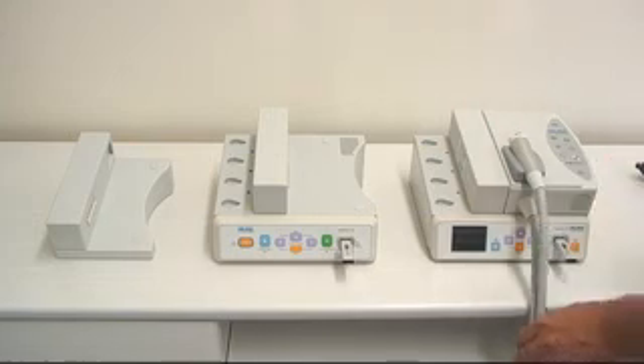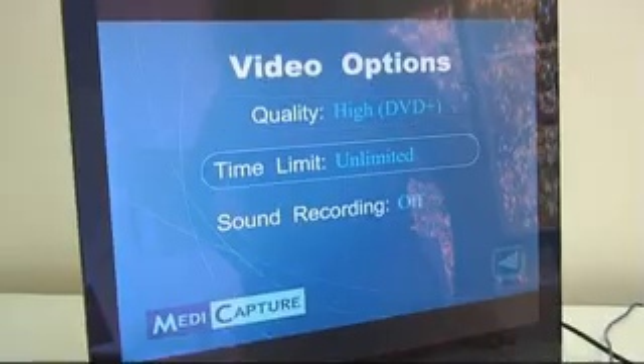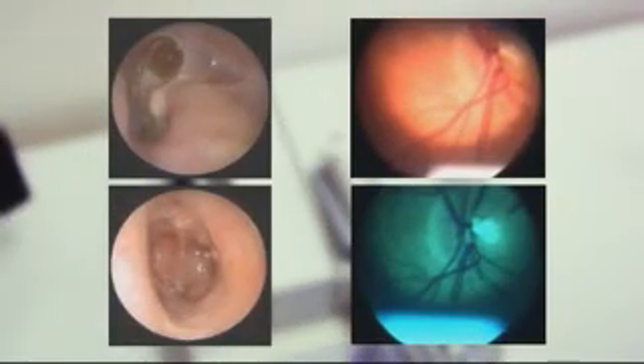The operation of the FlexiDoc 200 is identical except for the additional function to start and stop live recording. Video quality settings can be easily adjusted in the setup menu, allowing the user to control the amount of memory used while recording the examination. Still images can also be taken during a live recording, making the FlexiDoc 200 a truly universal camera solution for any clinical or office based environment.